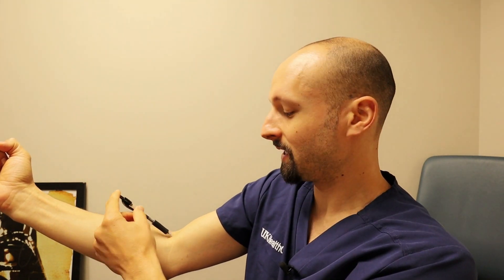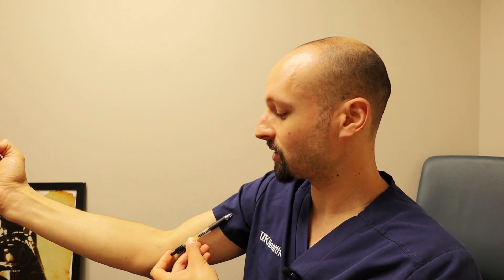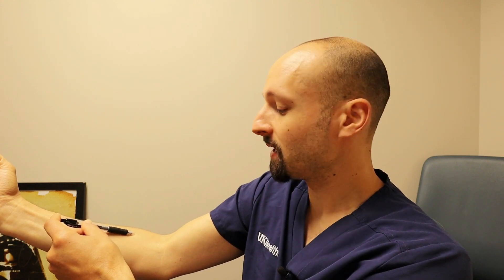Now the brachial — you have those two brachial veins right here surrounding the brachial artery. This one is great, but I would caution you not to go in the fold right here at the antecubital. Think about the arm like this: if you do your cannulation right in that area and bring the catheter in that way, it's going to be very difficult to scoop the catheter and go up. So you want to go either above or below the antecubital — that way it's much easier to slide the catheter in. If you go right at the antecubital, getting the back angle is too tricky and you're much more likely to poke through the posterior wall.